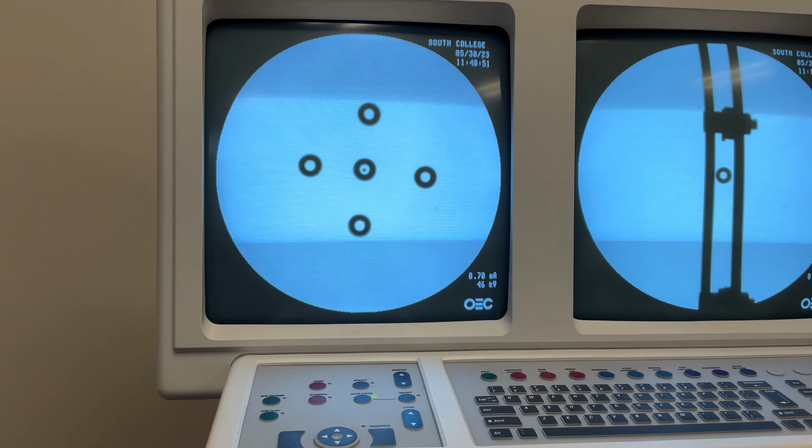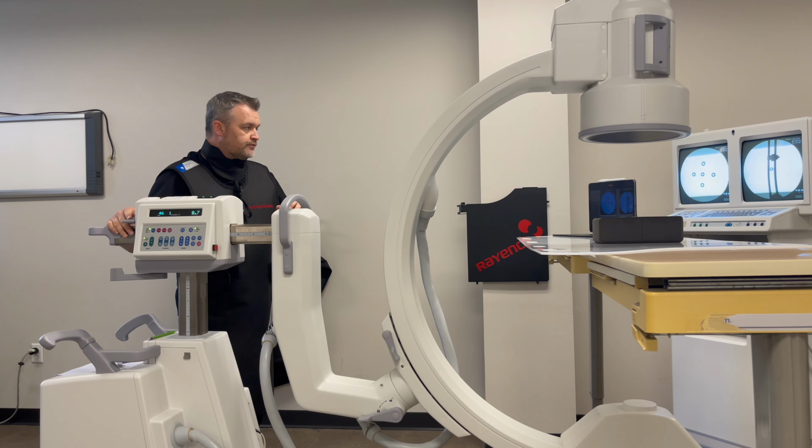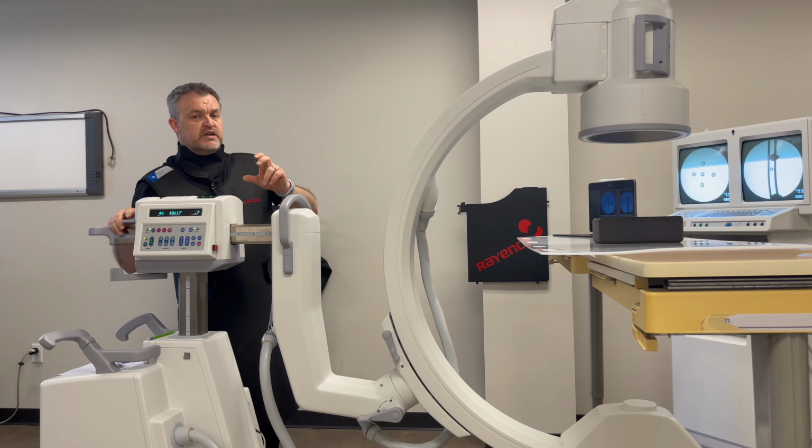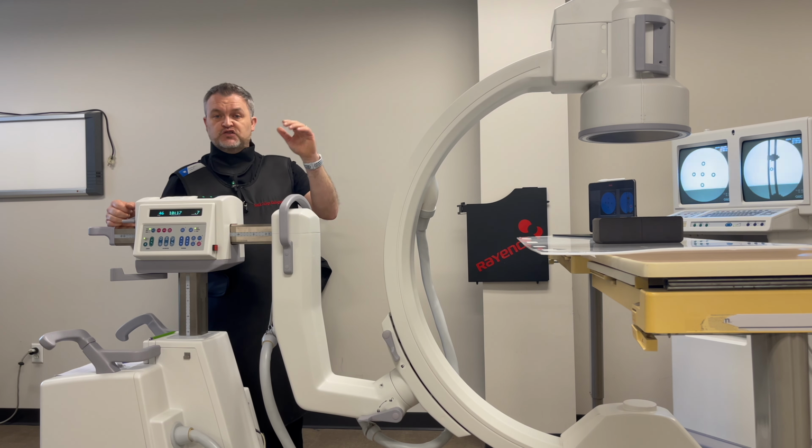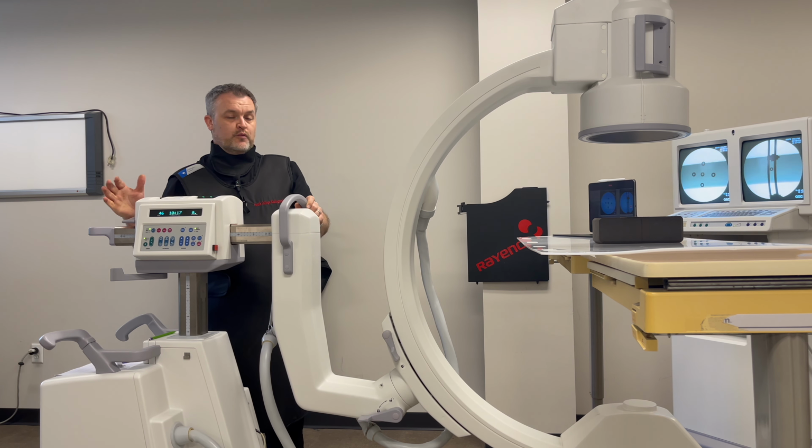Again, of those 6 or 7 exposures, they're all useful because the BB is placed exactly within the washer, and that level of reproducibility with the efficiency is beneficial for absolutely everyone, and that will make your life a whole lot easier in those tough cases.